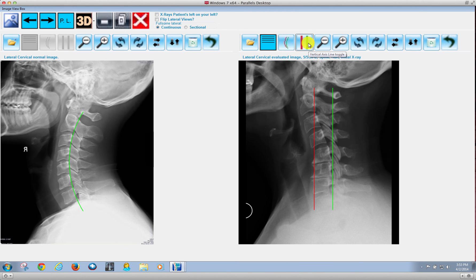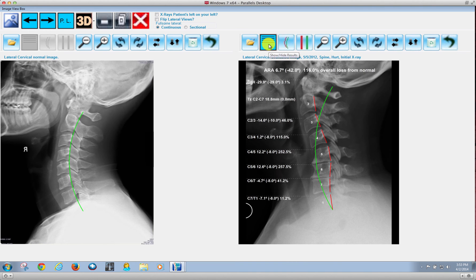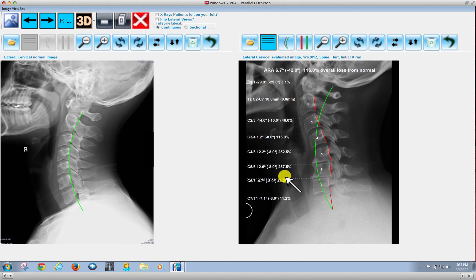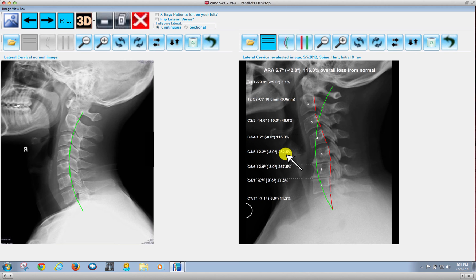In the prior version, we added the ability to show, when available, a translational line. But what's new now with the new text overlay is — look at this — we can actually show each segmental value, the relative angles, plus what the normal is, plus percent difference. So in this case, we could educate the patient that they have a 12.2 degree kyphosis at C4-5, which represents a 252.5% change from normal, as well as a 257.5% change from normal here.